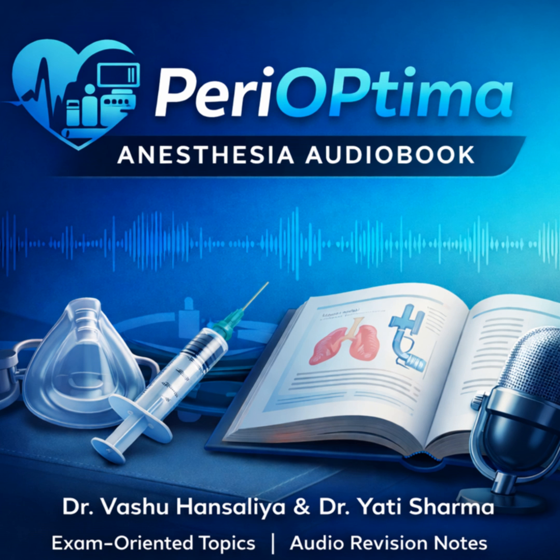And ventilation. What are the ventilator settings? The lungs are being supported by the ECMO. You don't need to blast them with high pressures. The goal is lung rest. What does that mean in practice? Very low tidal volumes, what we call ultra-protective ventilation, maybe 3 to 4 milliliters per kilogram, a low respiratory rate, maybe 10 breaths per minute. But you use high PEEP to keep the alveoli open and prevent atelectasis. The goal is to prevent ventilator-induced lung injury, or VILI.